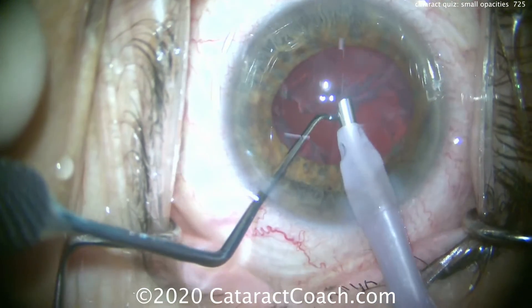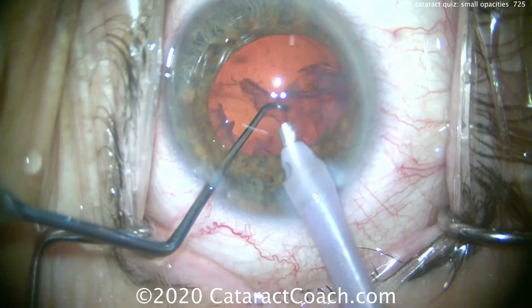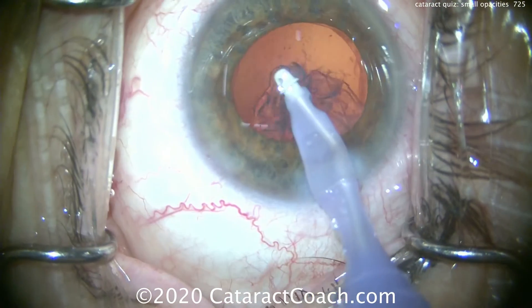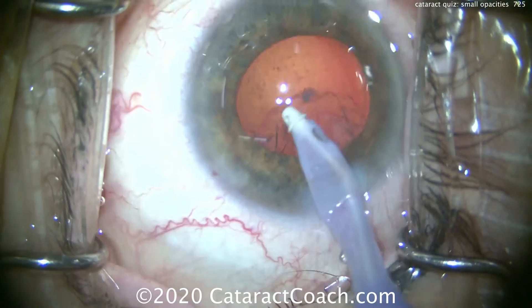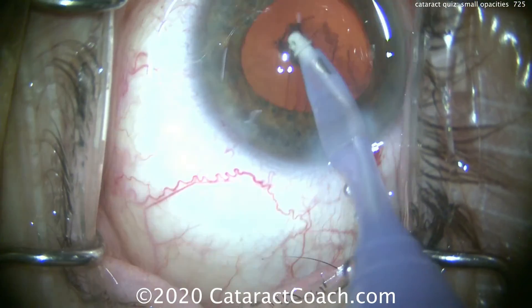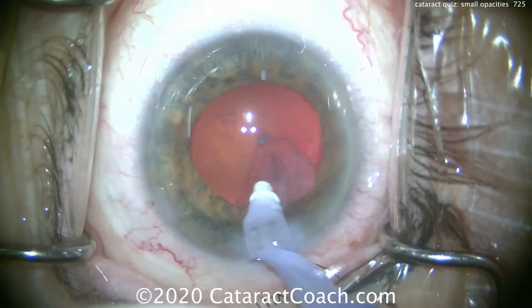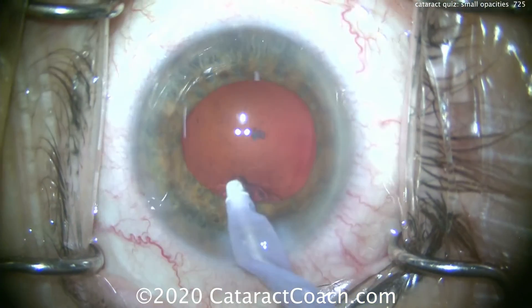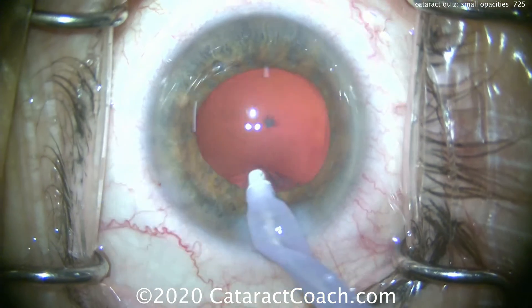The patient had good zonular support and strength. We were able to create a nice round capsulorhexis, and during phaco chop the nucleus was held beautifully in place. Now during cortex removal, look back in the center of the red reflex — those little dots or opacities are actually in the anterior hyaloid face. There's a little bit of fluid that went between the zonular support structures.